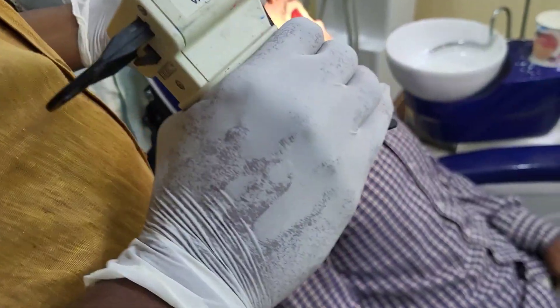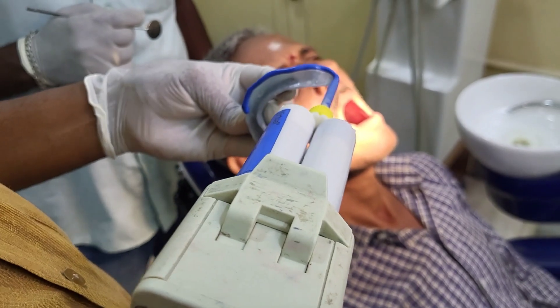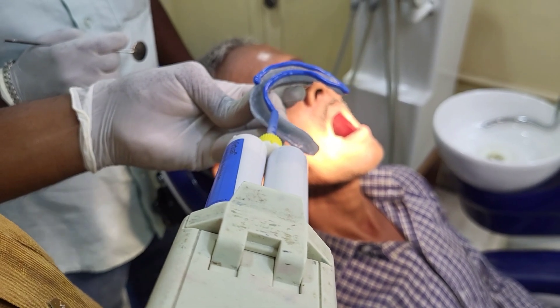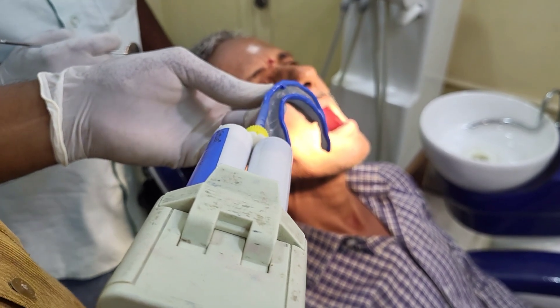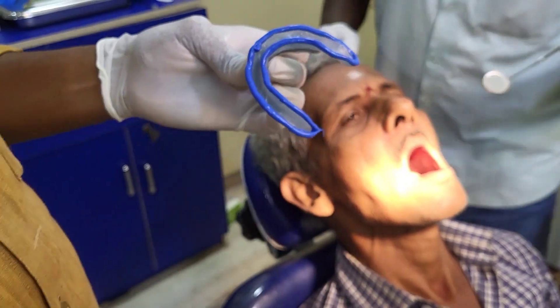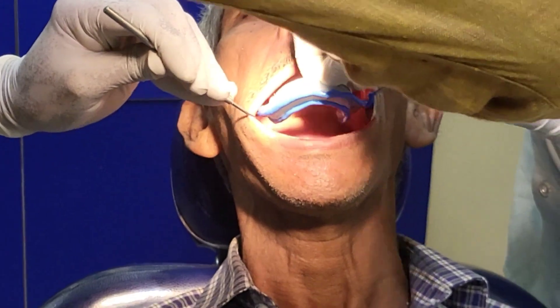We are going to use the heavy body putty from the IO Claw, applying it all over the surface of the borders in a single stroke. After application of the heavy body, we have to ask our assistant to retract the right side and we retract the left side, so that the tray will go inside the mouth without wasting putty on the cheek.